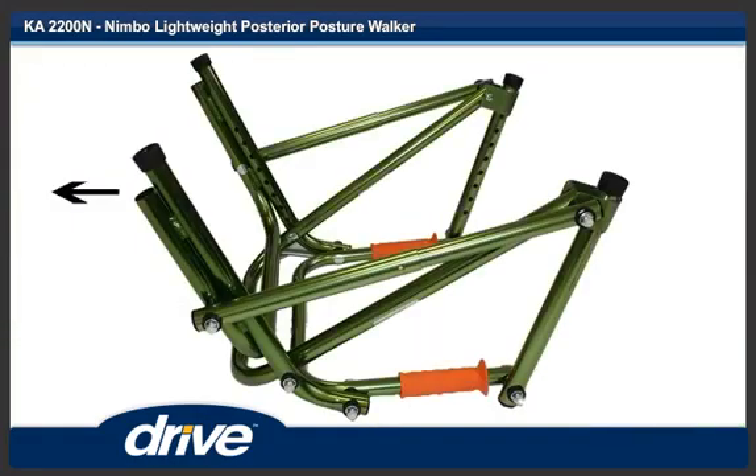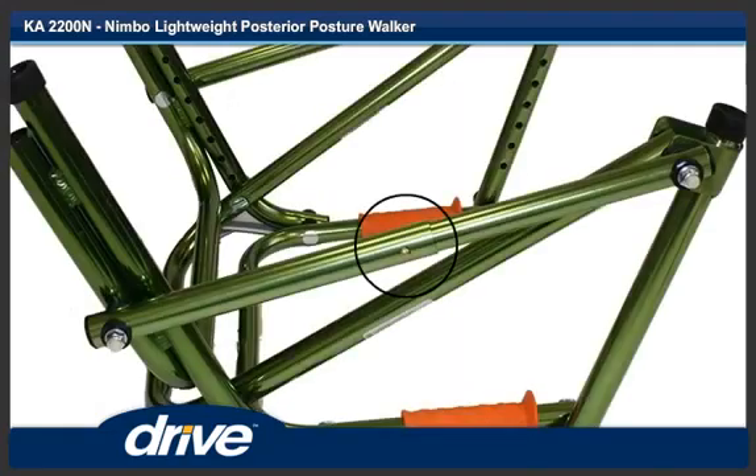Step 4. Unfold the main frame of the unit. Step 5. Make sure the cross strut locking pin engages into place.